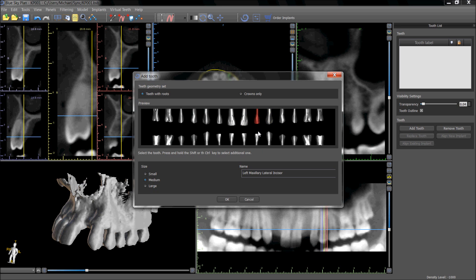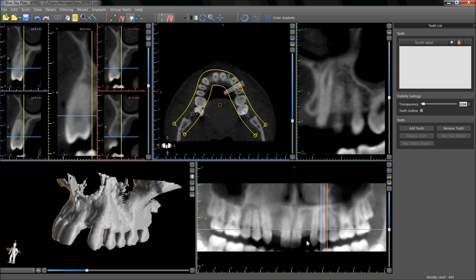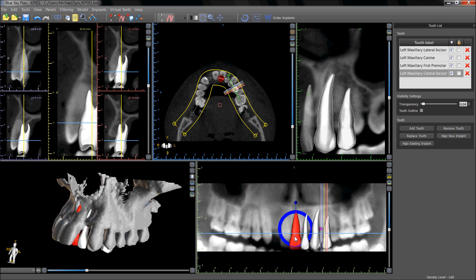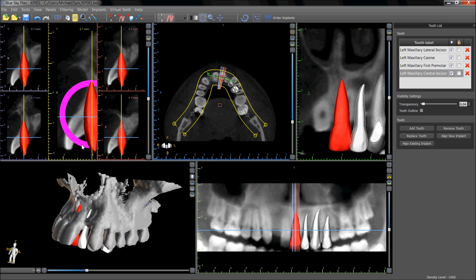To place multiple teeth, hold down the shift key and select the desired teeth. The tooth which appears in bright red will indicate the placement of the teeth being placed. The user can then click in the desired location for the tooth selected in bright red. The teeth appear in the treatment plan and the user can modify the placement, control the size, and rotate the teeth in any of the views.